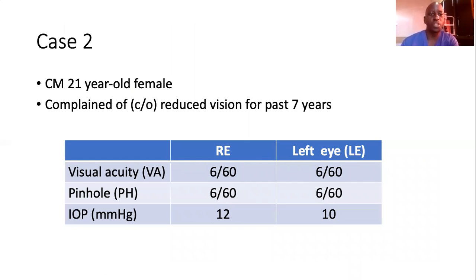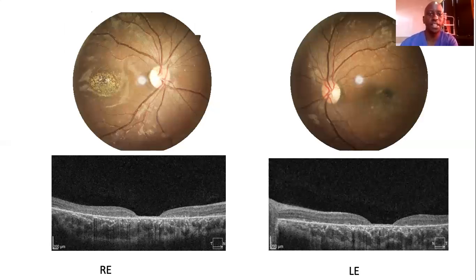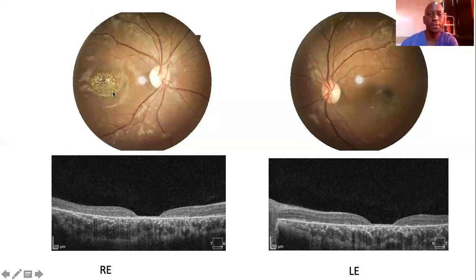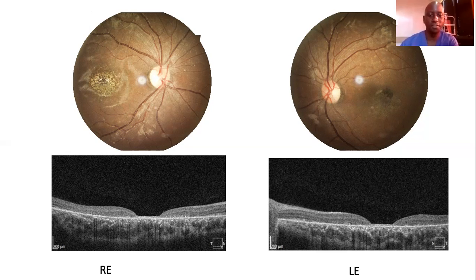The second case is CM, a 21-year-old female who complained of reduced vision for the past seven years. Her visual acuity was 6/60 in both eyes, and ocular pressure was 12 and 10. This case was slightly worse. On the fundus photo, you can see that typical beaten-bronze appearance with RPE atrophy, and a few areas of hypopigmentation in the periphery in both eyes. When you look at the macula, you see severe foveal thinning with almost all retinal layers affected — both outer and inner. It almost looks like a macular hole because of the severe foveal atrophy, with the contour of the macula totally lost.